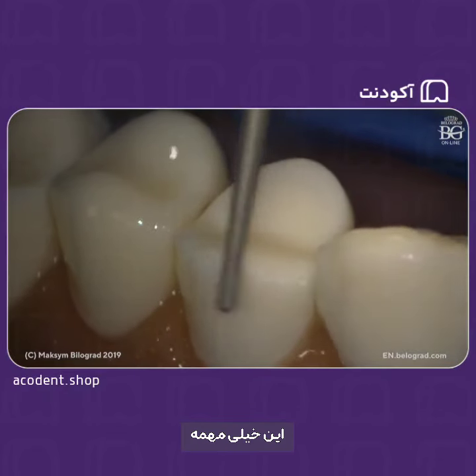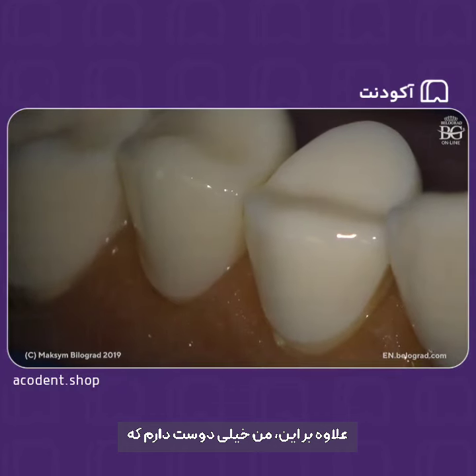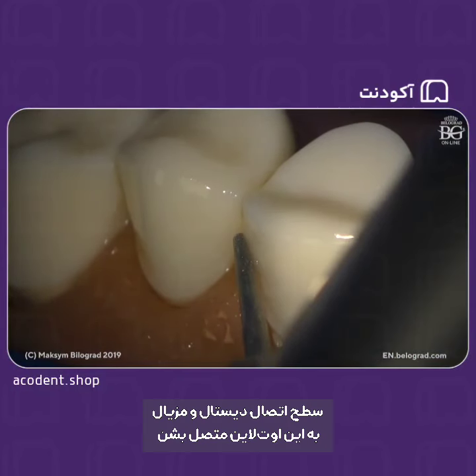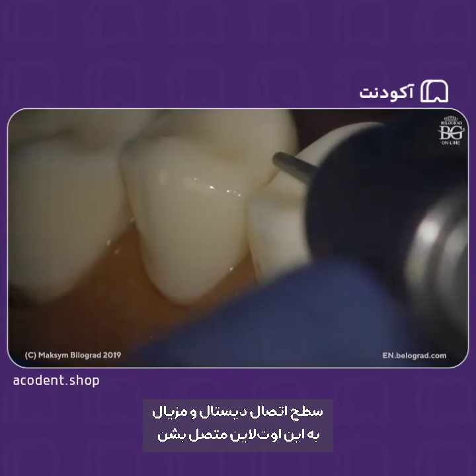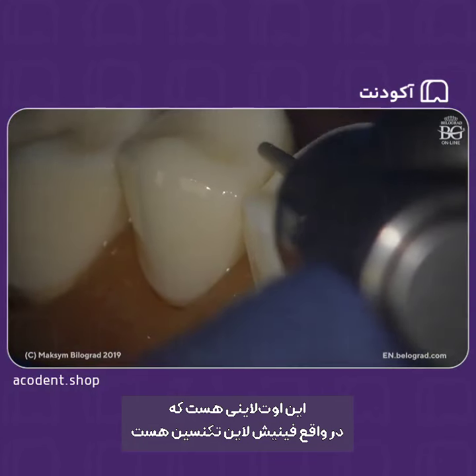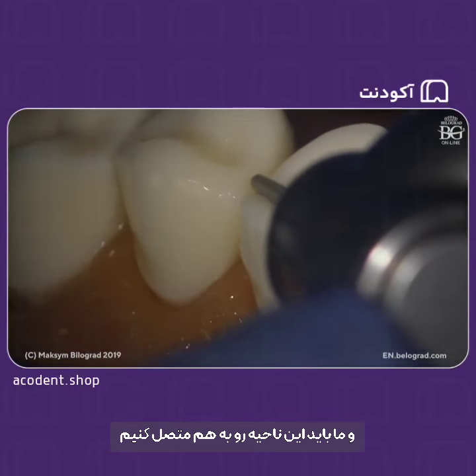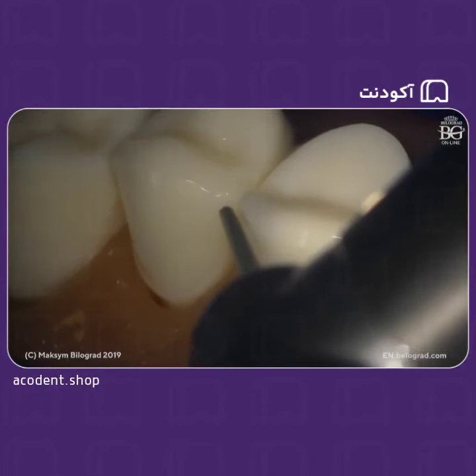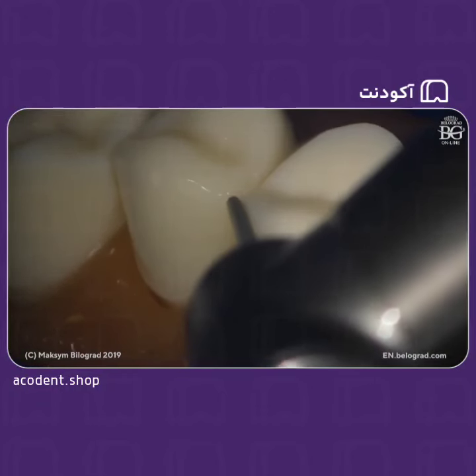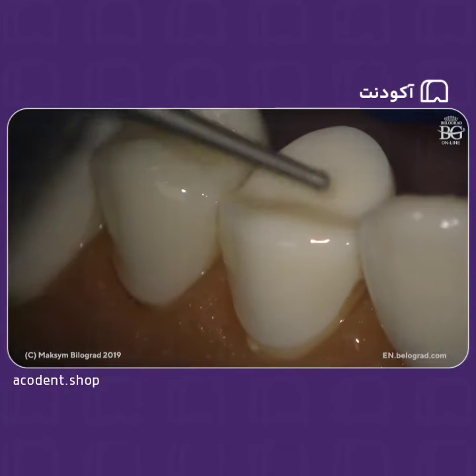This is important. Okay, also what I would like to see is distal and mesial transition joining this outline. This is the outline which is the finish line for your dental technician. So we have to join here. Same from mesial.